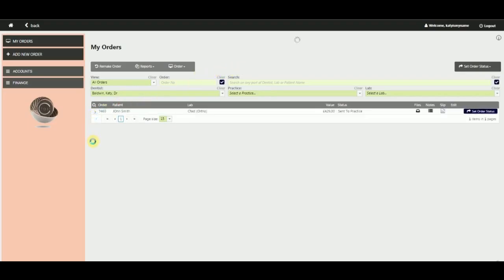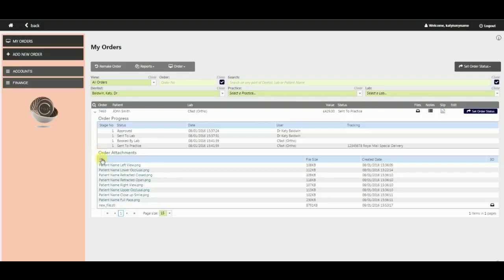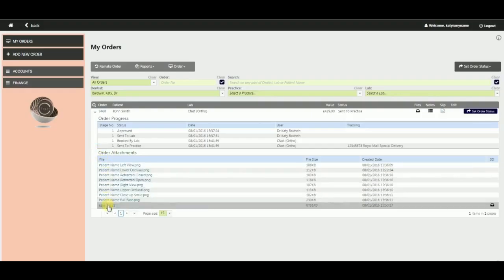This includes any attachments you or the lab may have added. You can either click on the title of the file to download it to your computer, or if it is a 3D record set, you can click this icon to view it online.